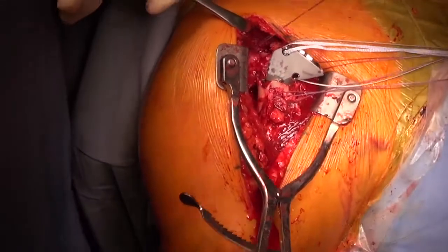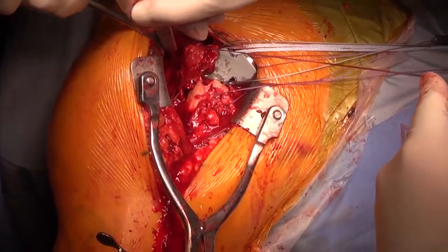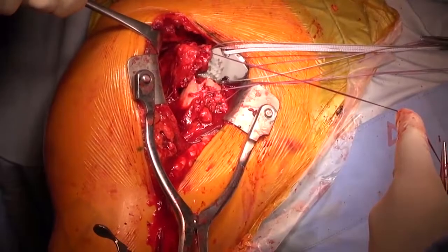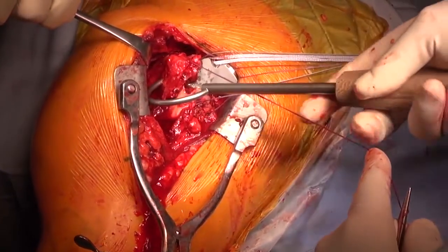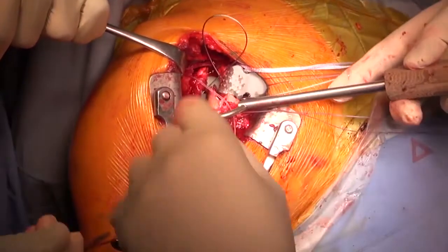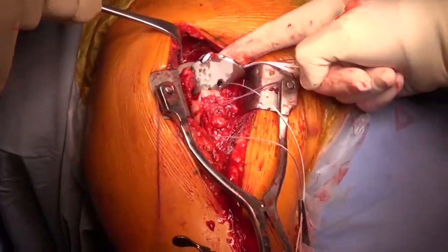Repositioning of the greater tuberosity. Incision at the tendon insertion. Threading the cable through the bone-tendon transition. Reduction of the prosthesis.